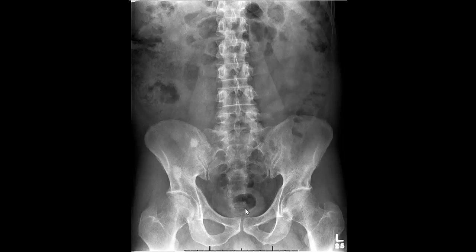First, we want to determine small bowel from colon. You can do this a number of ways — look for the expected anatomic location of the colon, with the descending colon on the left, the ascending colon on the right, to varying degrees depending on how much air is within it. Depending on how redundant the sigmoid colon is, you would expect it to be seen down in the pelvis. The small bowel will be more central. Other differentiators include the mottled appearance of feces within the colon, haustral markings in the colon versus valvulae conniventes in the small bowel, which should be more circumferential around the entire small bowel.